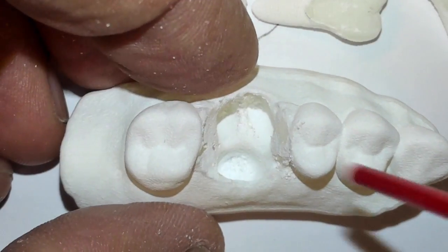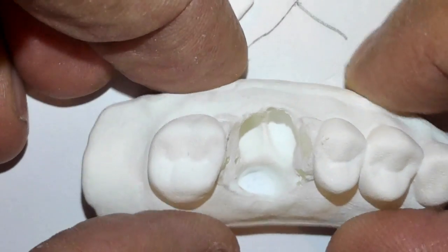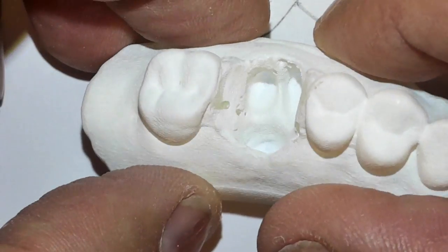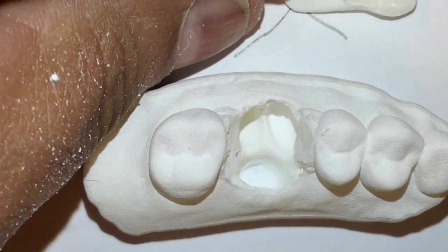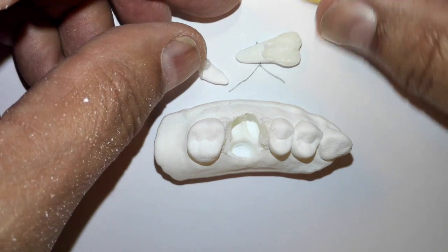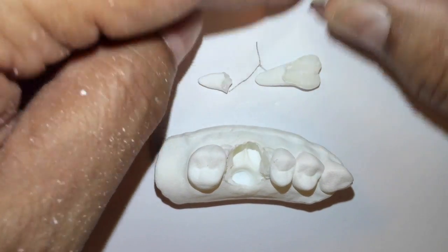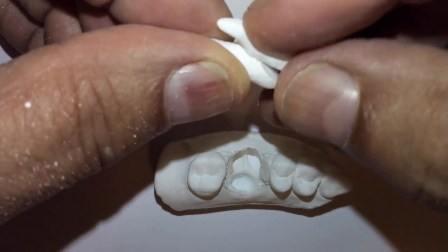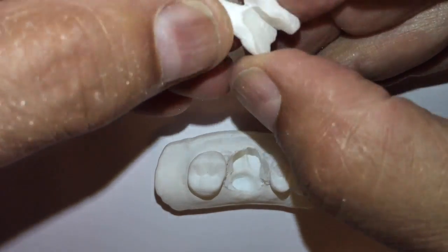So there you have it — the atraumatic removal of tooth number three. First time doing this with the printed model; I think it turned out really well and hopefully everybody has fun with it. We were doing these with poured models, but I think you'll learn a lot more doing it with this one — a little easier, a little more understandable. Again, the sequence: you want to see the tooth as it exists. So this was the distal buccal conical root, the mesial buccal — more of a flat ribbon-shaped root — and of course the palatal. If you glue these together you can try to do that, though I'm not sure how successful you would be. But anyway, success!